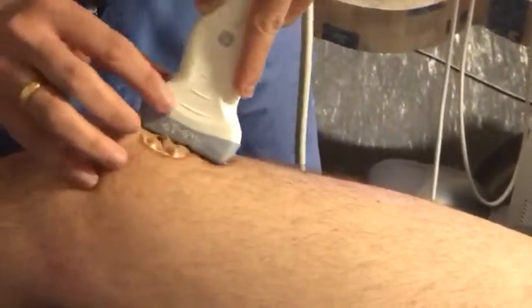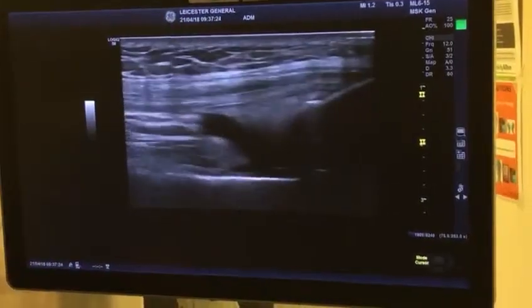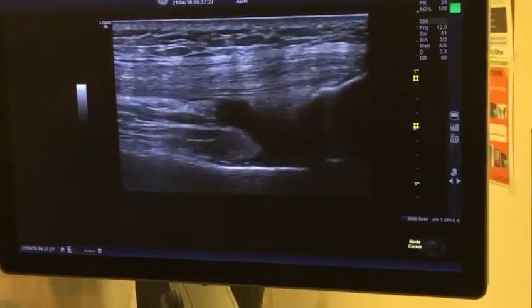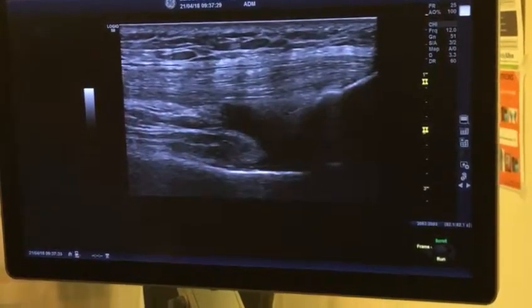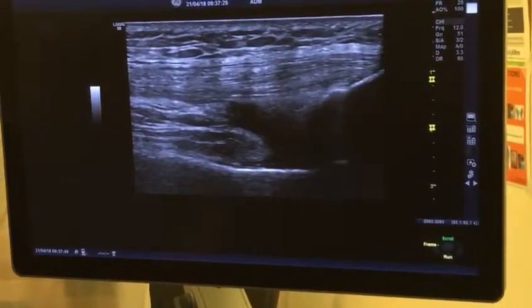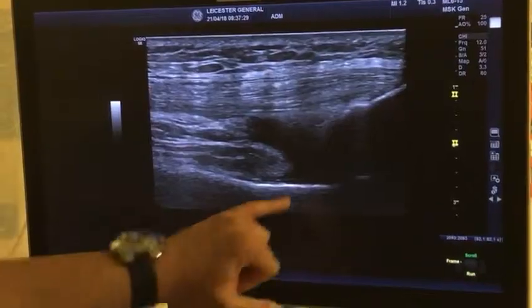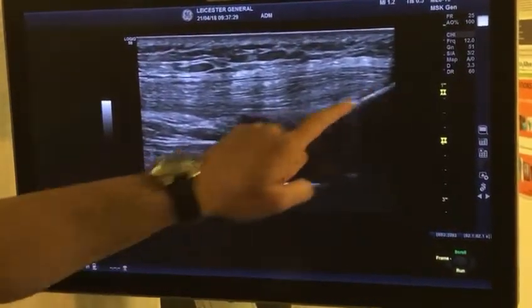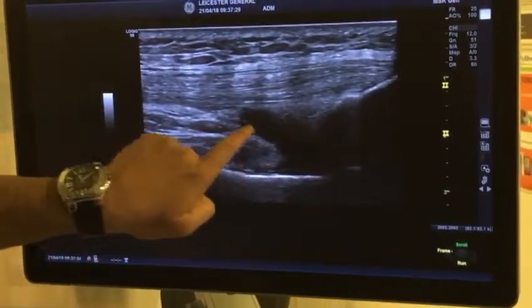On the image, right is distal and left is proximal. I'll increase the gain and depth. The structures you can identify: that bone there is the patella, and the other bone is the femur. You have the femur, the patella, the quadricep tendon, and this black thing here is basically the suprapatellar recess.